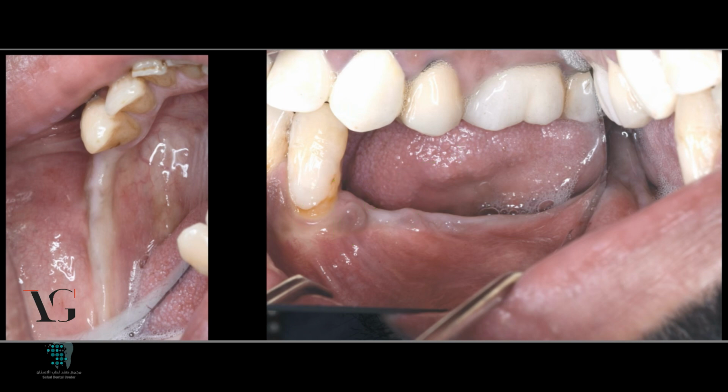Why? Because if we do a cut in this area, we are sacrificing the height of this papilla. So the height of the papilla will collapse, and then we will have an exposure of the canine. And this is exactly what happened with the patient when he had his previous implant surgery and he had a failure of his implants.